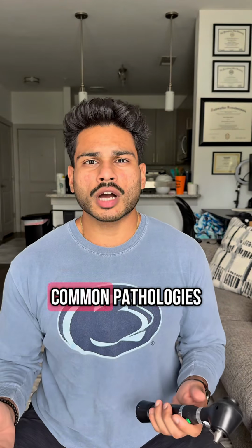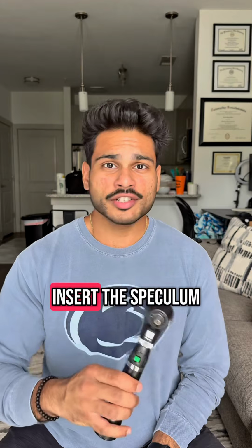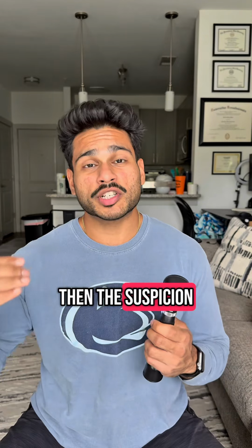Now let's talk about the common pathologies. So if you, let's say, look at a normal ear and then you come on to the bad ear, if you cannot insert the speculum, then the suspicion for swimmer's ear goes up.